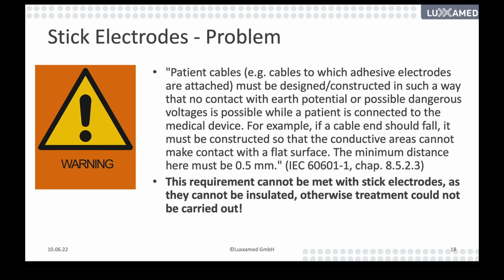But then, if you look at this, it's not possible to work. You cannot insulate the part where you want to work on the patient's body. So this requirement cannot be met with the stick electrodes, as they cannot be insulated. Otherwise, the treatment could not be carried out. Yes.